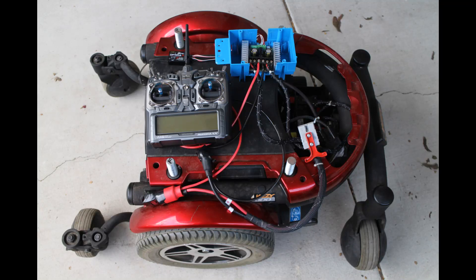The first step in converting my Jazzy 600 wheelchair base into an animatronics and robotics platform was to remove the electric brakes from the motors. One note: removing the brakes made the original joystick inoperative, but did still allow me to use the charging system.